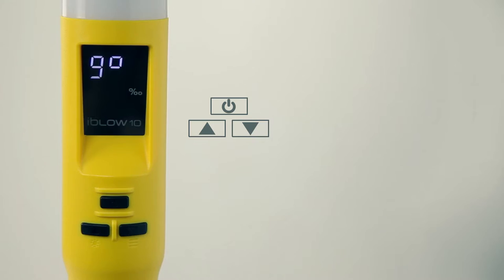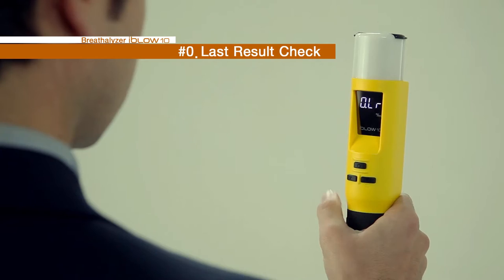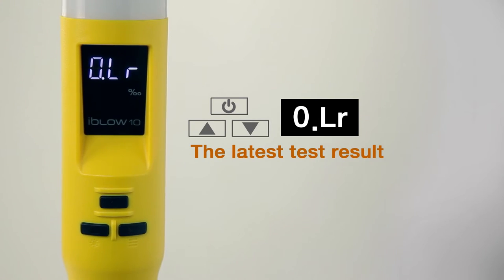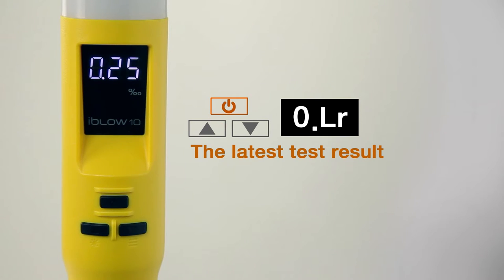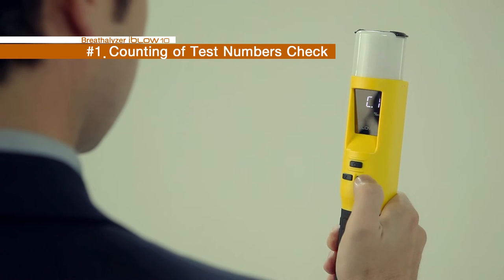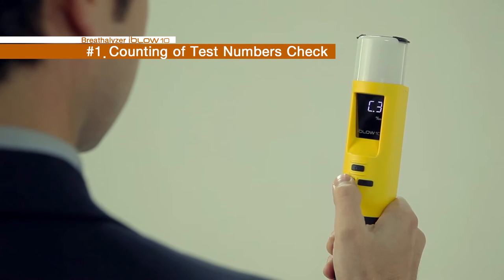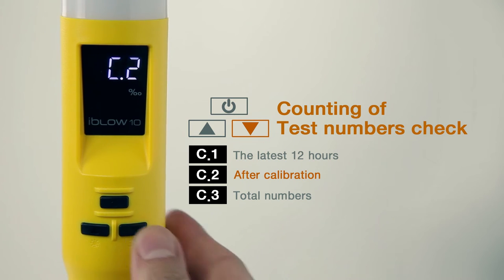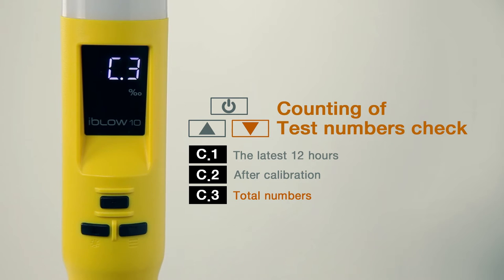iBlow 10's menu is displayed when the down button below the power button is pressed and held down. The first mode, OLR, is a menu showing the latest test result and displays the most recent result. 1CT is a mode that displays the number of tests conducted and shows three types: C1 is the number of tests conducted in the latest 12 hours; C2, tests after calibration; and C3, the total number of tests carried out.